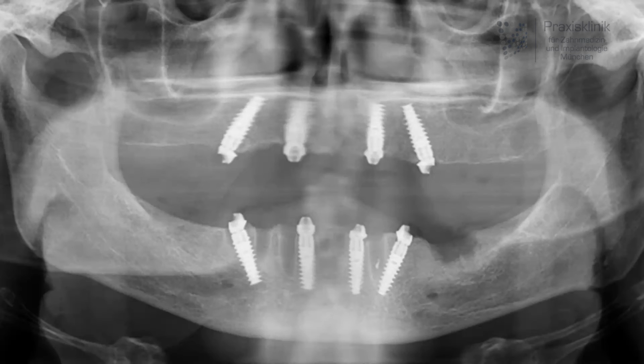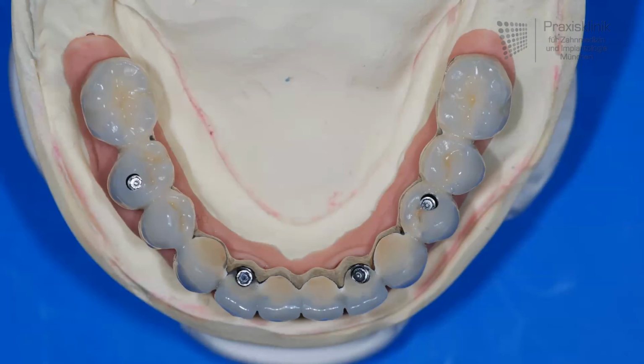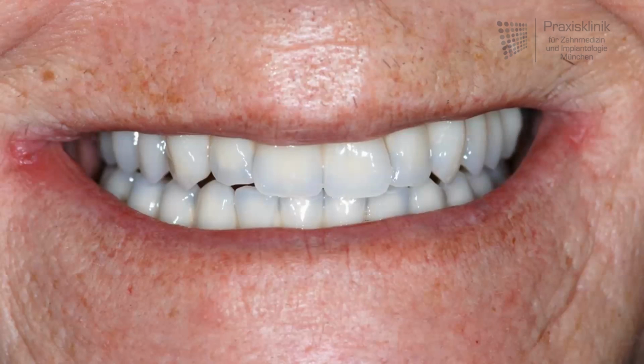Having a very exact implant position with regard to the definite restoration, it is very easy for the dental technician to finalize this restoration. Here in the last X-ray image we can see we have 2 screw-retained bridges in the upper and the lower jaw, and the intraoral situation looks very nice and aesthetic. So even the last picture showing the smile of the patient is very satisfying.